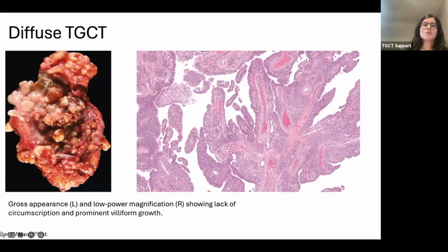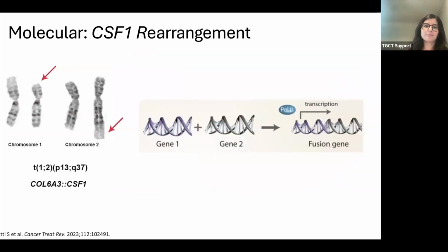So in addition to the brown pigment that we see, hence the pigmented component of the name, there's the villiform, the villus component, and then of course you have the nodules of the tumor itself. So kind of makes sense why these were called pigmented villonodular synovitis. And obviously synovial component reflecting the last portion of that name.